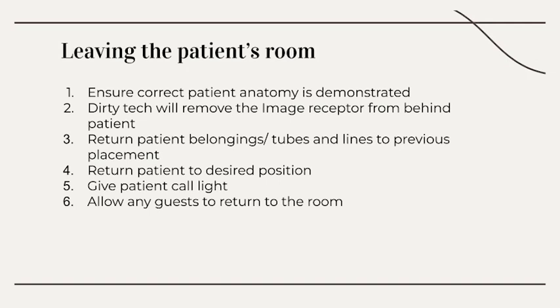Leaving the patient's room. Both techs may ensure correct patient anatomy is demonstrated. The dirty tech will remove the image receptor from behind the patient. The dirty tech will return the patient's belongings, tubes, and lines to previous placement. Dirty tech will help patient return to desired position. Dirty tech will give patient call light, then allow any guests to return to the room.